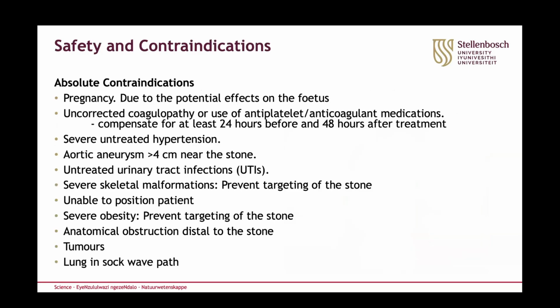Safety considerations, looking at absolute contraindications: pregnant patients due to the potential effect to the fetus, uncontrolled coagulopathy or the use of antiplatelets or anticoagulation medications, severe untreated hypertension, aortic aneurysms more than 4 centimeters close to the stone, untreated urinary tract infections, severe skeletal malformations preventing targeting of the stone, and if it's unable to position the patient correctly, severe obesity preventing targeting of the stone, and anatomical obstructions distal to the stone preventing fragmentation clearance, as well as tumors or if the lung is in the path of your shockwaves.